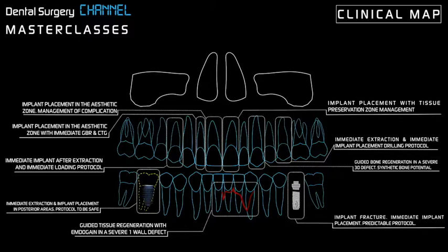So in this case, that actually required an implant placement in the anterior area, in a central incisor. We managed a very big amount of bone loss and a very big infection without damaging that protected zone.